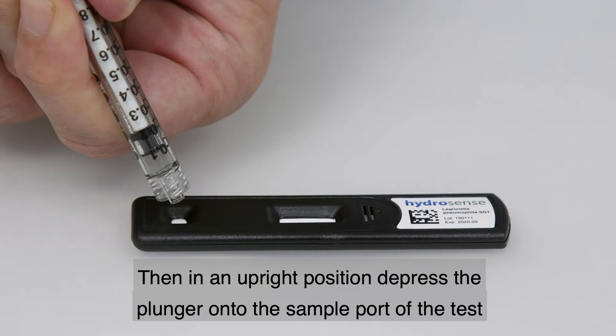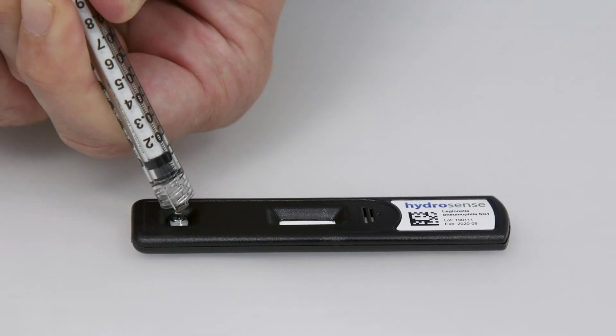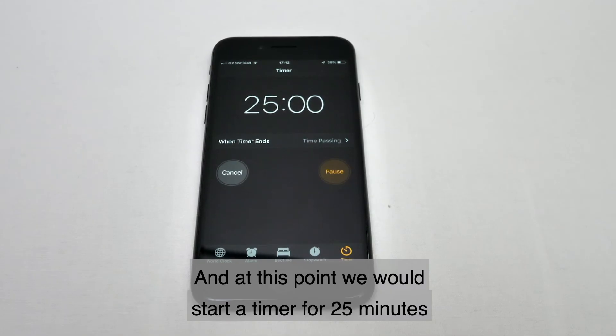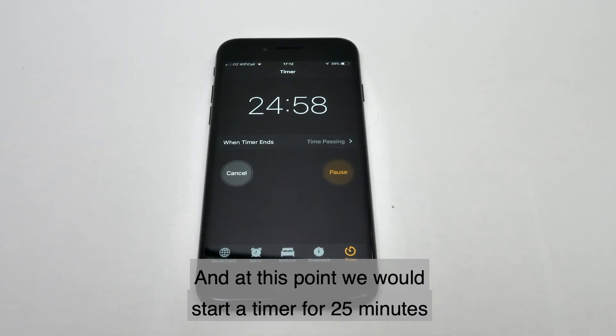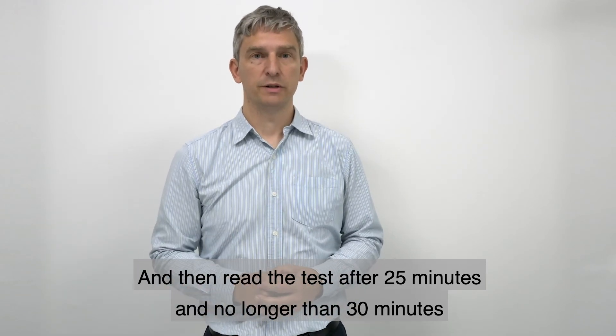Then, in an upright position, depress the plunger onto the sample port of the test, dispelling all of the sample. At this point, start a timer for 25 minutes, then read the test after 25 minutes and no longer than 30 minutes.